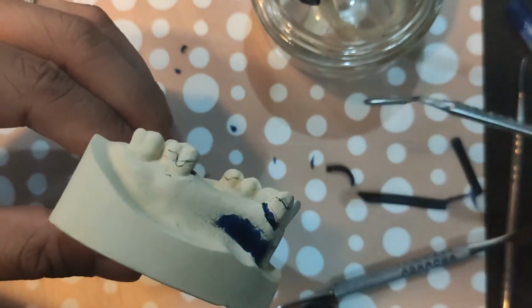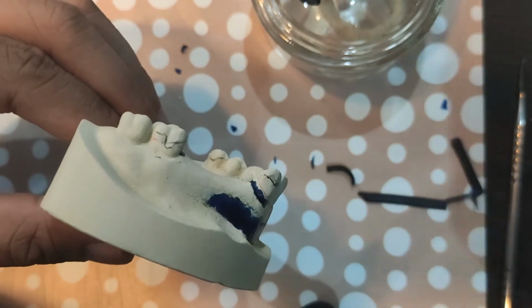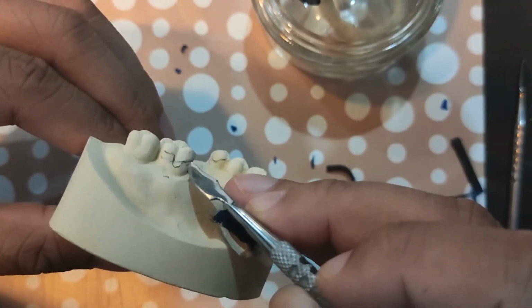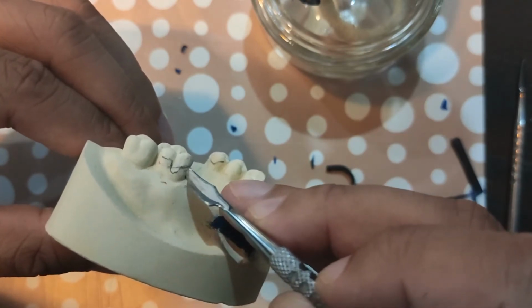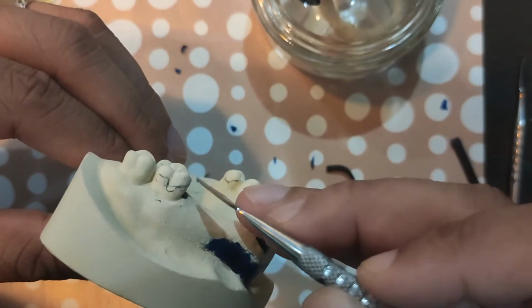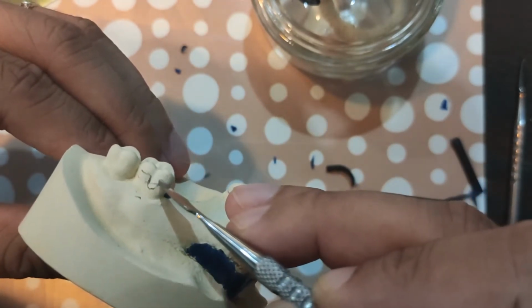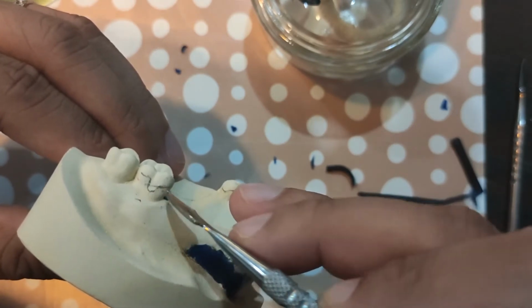And remember, I also slightly marked where the inferior border of my C-clasp is going to be para madali ko siyang mailagyan ng shape blockout. So the rigid third emerging from the mesial and the semi-rigid third needs to be above the survey line, right?